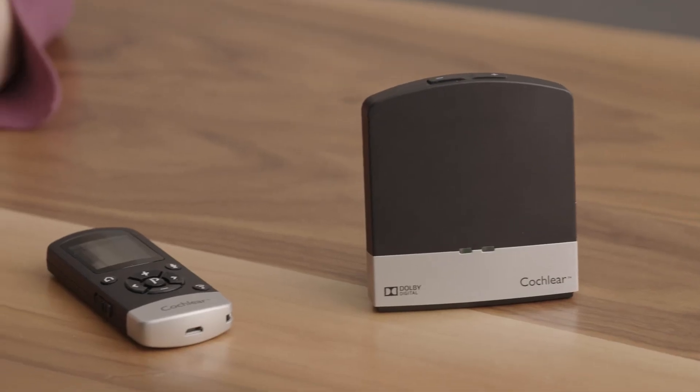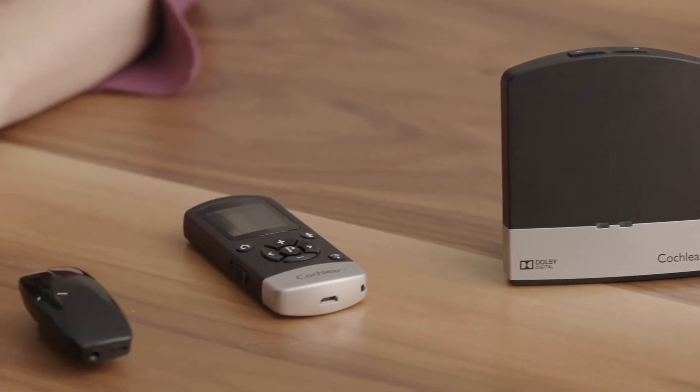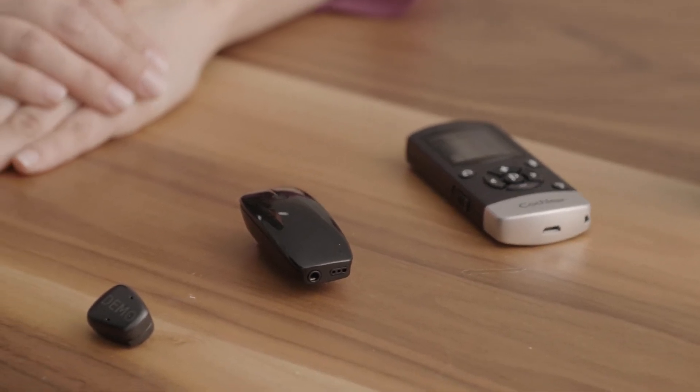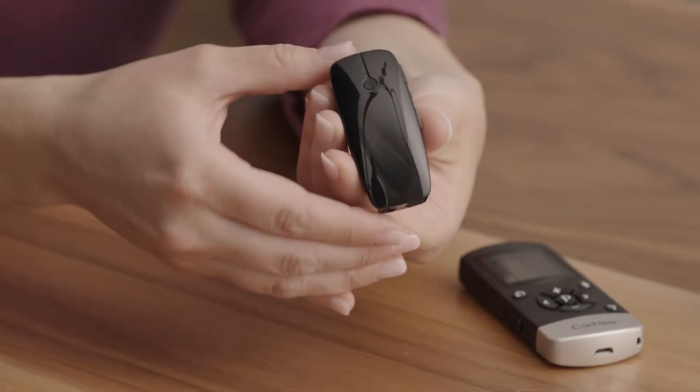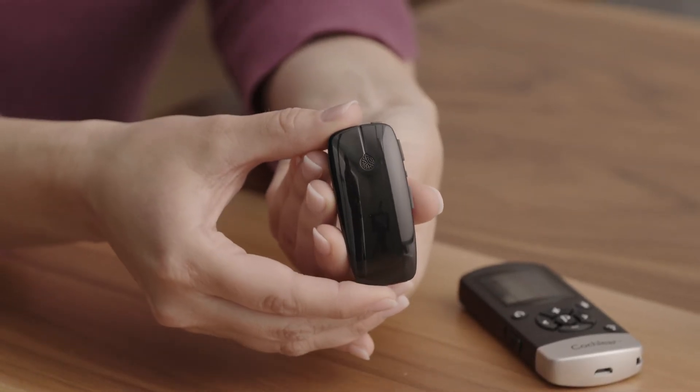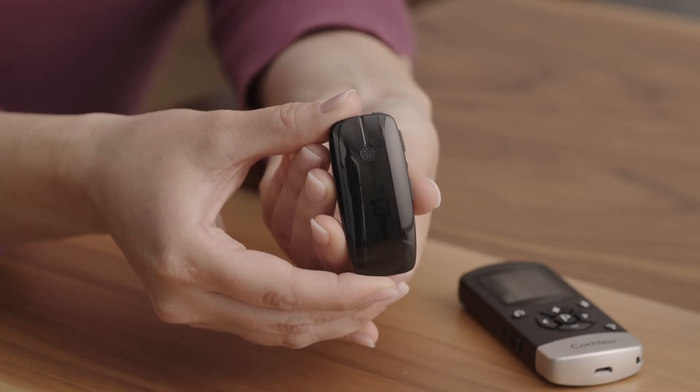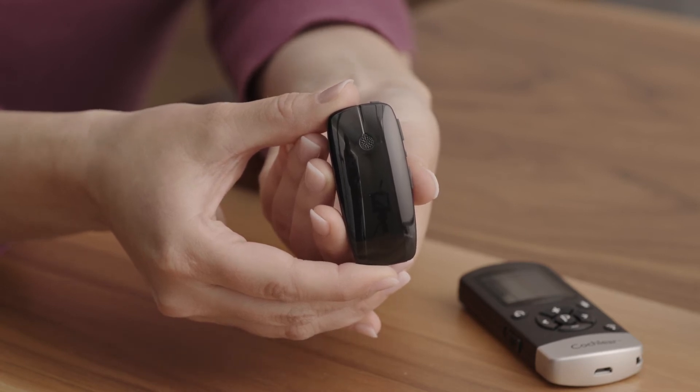Now we'll review the additional wireless and other accessory options available. Your kit may include one or more of these options depending on the selection by you or your audiologist. The Cochlear Wireless Mini Mic 2+ is a helpful tool for situations where you may want to hear someone at a distance, such as in church, in a classroom, or in noisy environments like a restaurant. Think of your Mini Mic 2+ as your extendable ear — up to 82 feet.